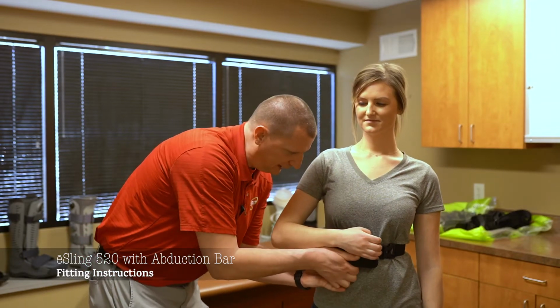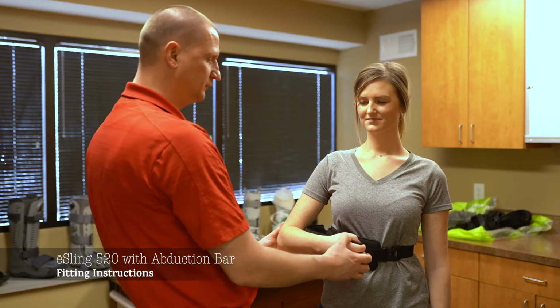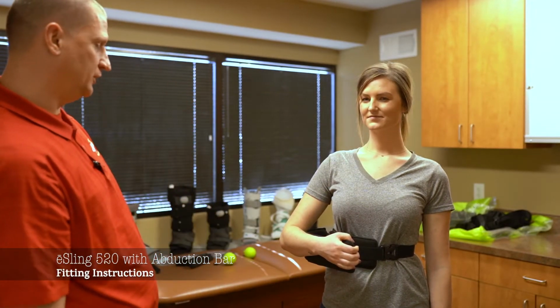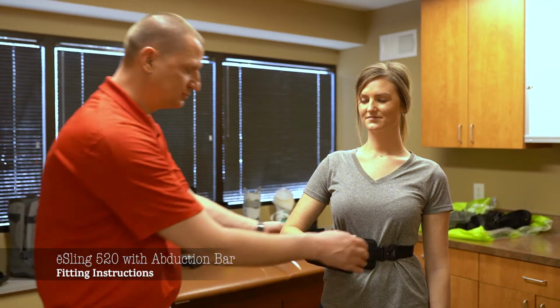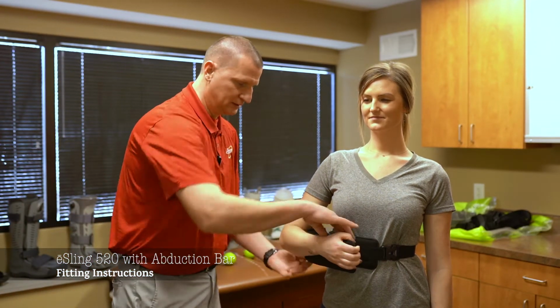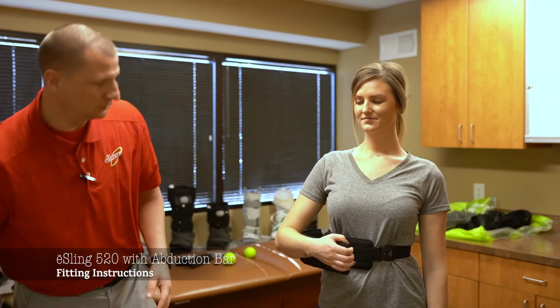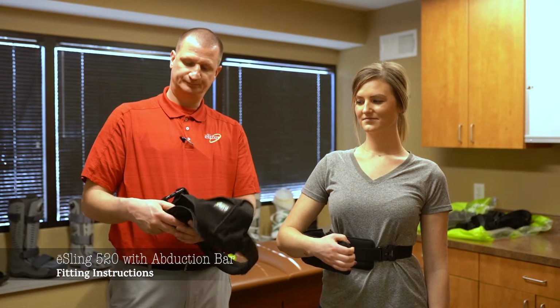So we are coming back into this position here, okay? We always have the patient hold to give a visual of where she'll be sitting. Once we have this secured to her side, mounted where we need, then we can get into adding the cradle. Okay?